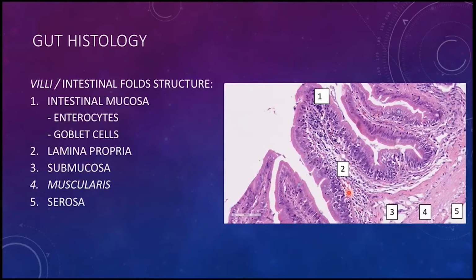The second region of interest would be the lamina propria that, together with the submucosa underneath, are regions made out of connective tissue that provides structure to the intestine. As you can see, there are some cell populations, and that's normal, not necessarily inflammation. It's normal to have a certain amount of resident lymphoid cells, for a very simple reason.